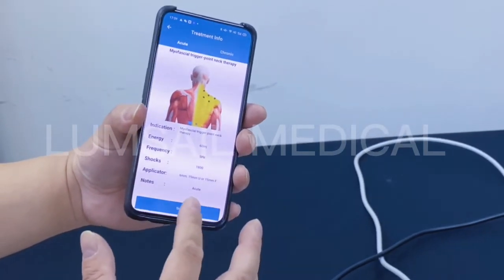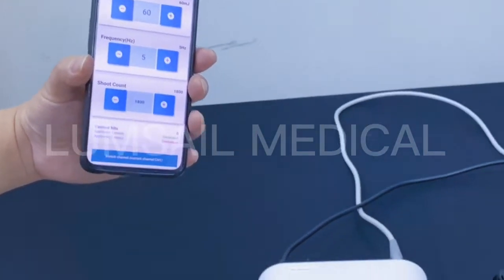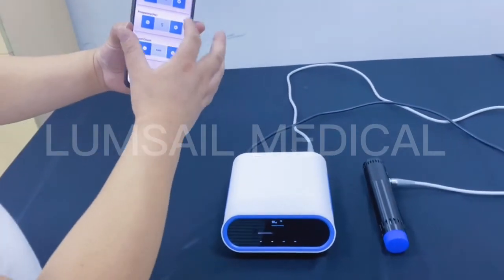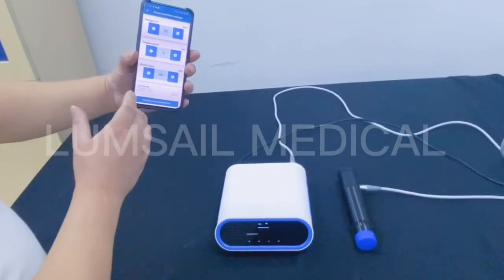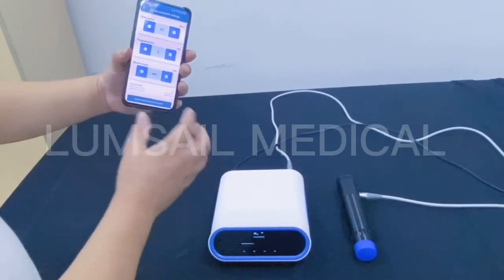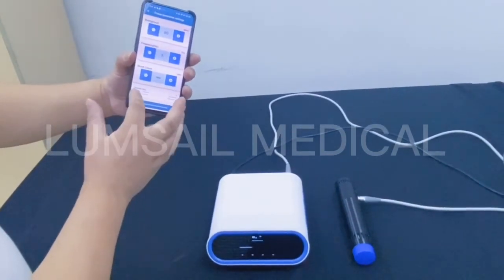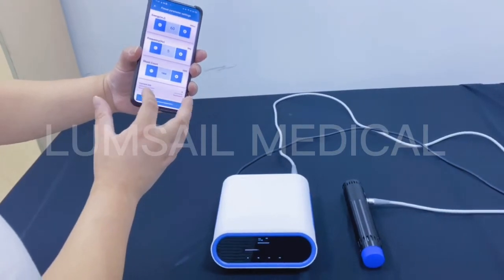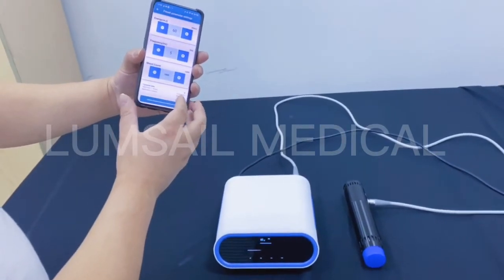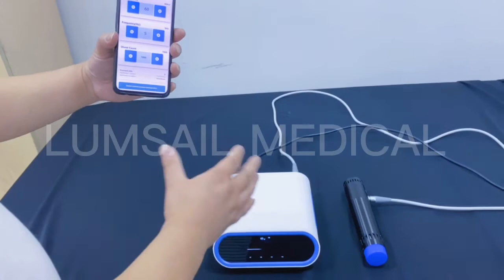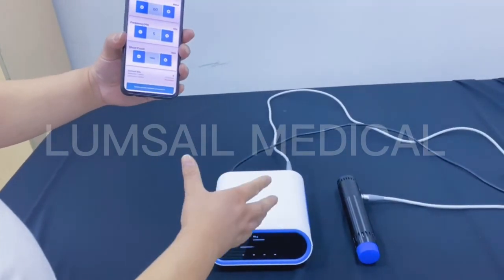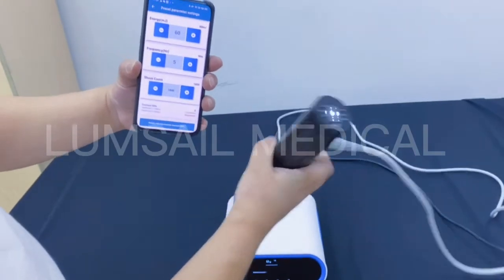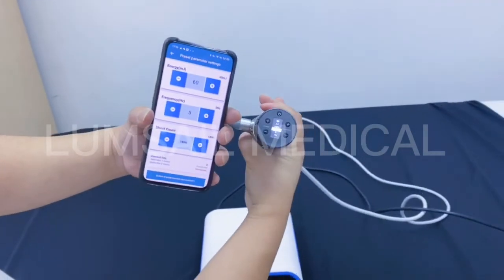We proceed and the machine is activated. You can see the default parameters are set, and the status of the machine is displayed — current heat is zero, applicator one is connected, and applicator two is not connected. This machine can connect with two handpieces. For the demo we are connected with one, and you can see the parameters are also set on the control panel of the handpiece.